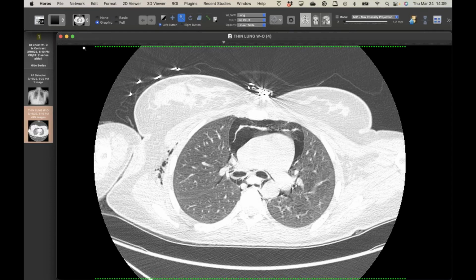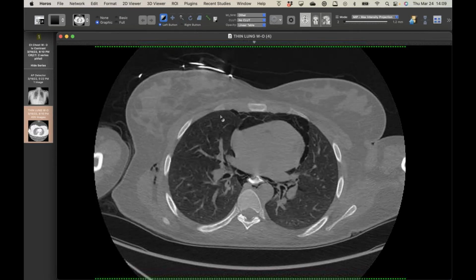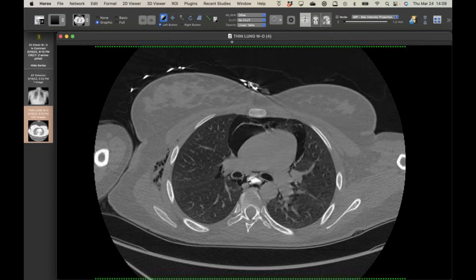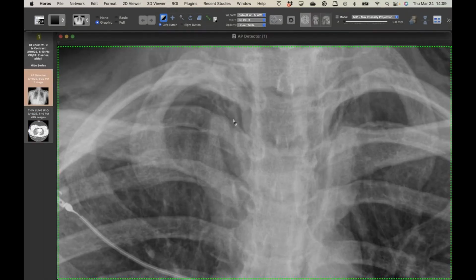Oh yeah, I don't know if we did this as an esophagram protocol or not. No, this is just contrast from the belly, but you can see we got a free esophagram out of this one as well. So Macklin effect, pseudopneumothorax, mimicking a real pneumothorax, and pneumomediastinum.